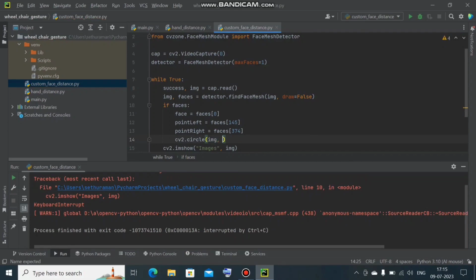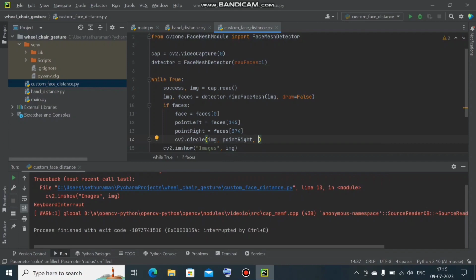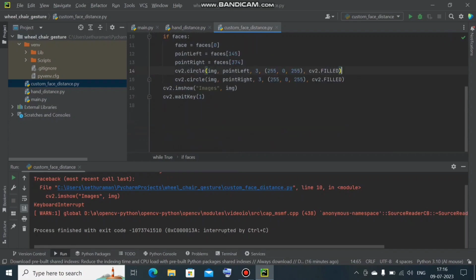So in the image I need to draw the point left, with a radius of, and color of 255, 0, 255. Thickness we will make cv2.FILLED. We need to do the same thing for the left eye: down we will make it left, and up we will make it right. Okay, let us see now.